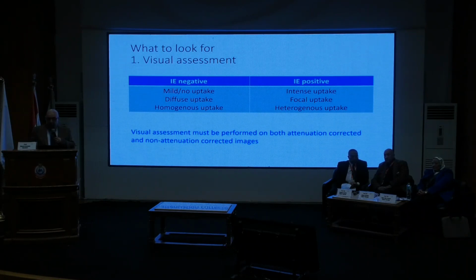And of course, the visual assessment should be done in both AC and non-AC images. This is very important because the prosthetic valve can lead to artifacts and can lead to false positive in the AC image. So we have to confirm that the uptake is present in the non-AC image.